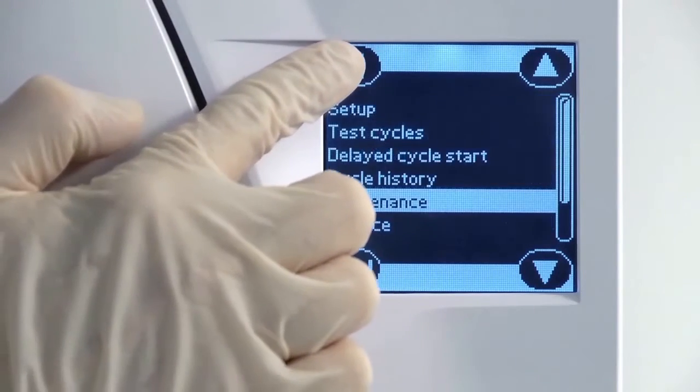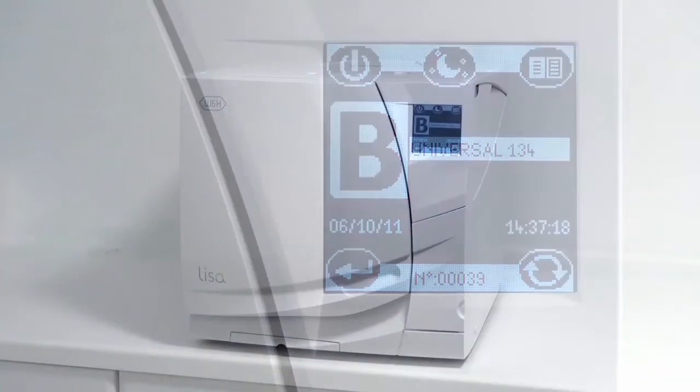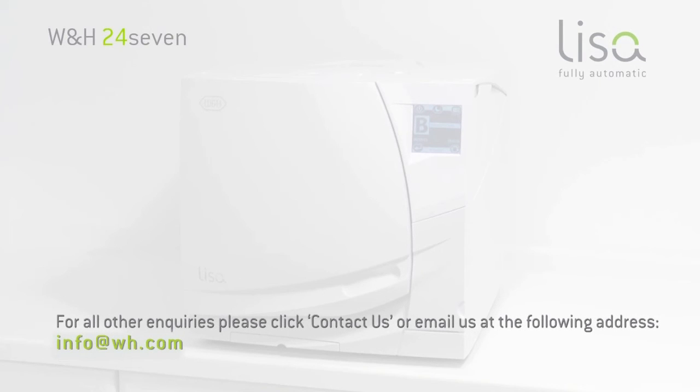Now navigate back to the cycle selection screen to return your Leaser steriliser ready for normal operation. Further information on product maintenance, compliance testing and current national decontamination guidance can be found on this website. For all other enquiries, please click Contact us or email us at the following address.